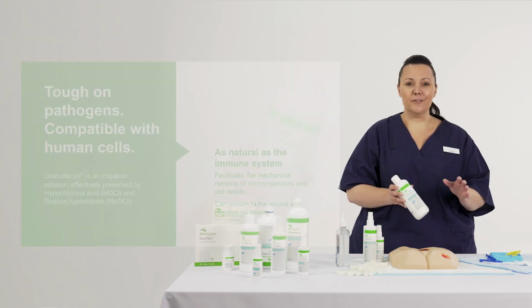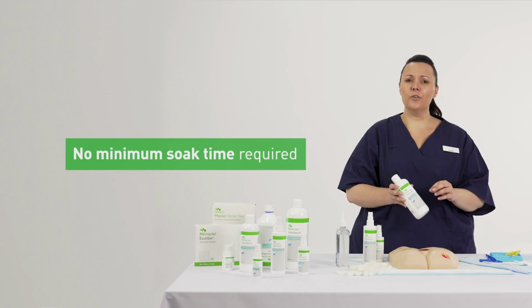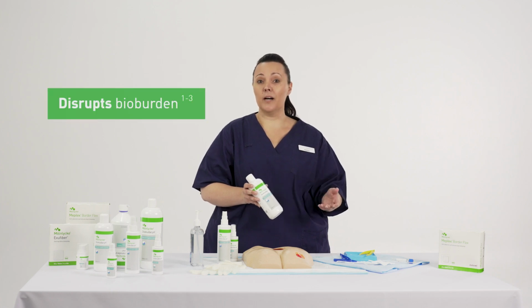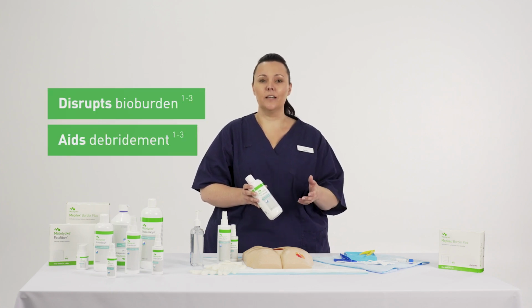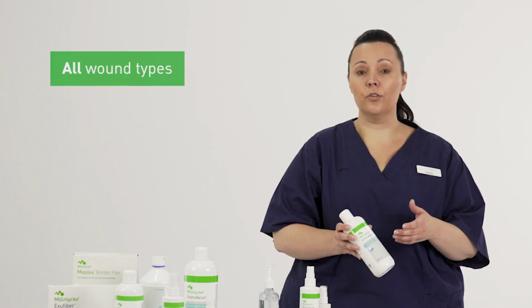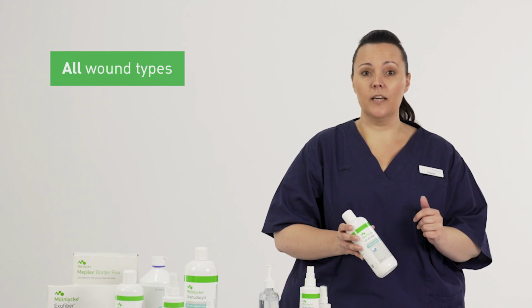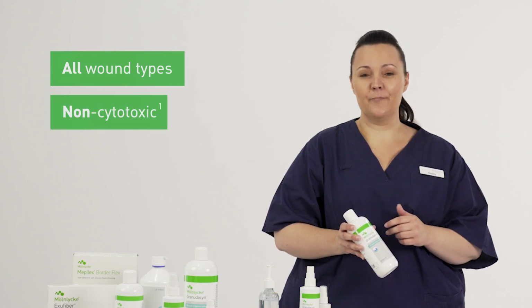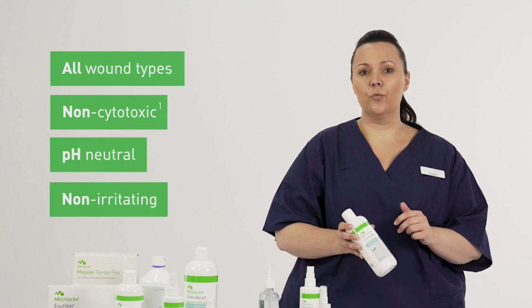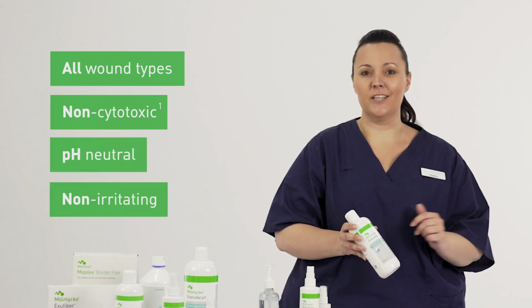There is no need for soaking. However, if the wound tissue is crusty, then you may want to consider a soak. Hypochlorous acid is effective in disrupting bioburden and also aiding debridement. Granudacyn can be applied to all wound types, including chronic, acute, and complex wounds, and it is non-cytotoxic. Granudacyn is pH neutral and is non-irritating to the wound and fragile surrounding skin.